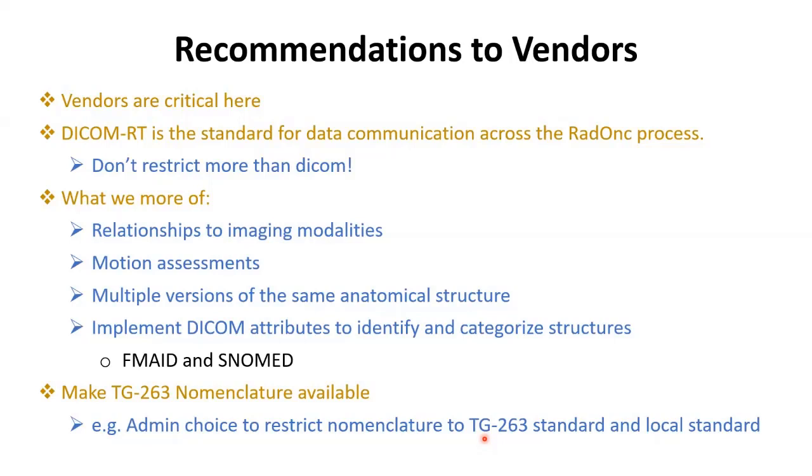The second question: you are saying that you have PTV 70 gray and PTV 66, right? Or 60 gray?